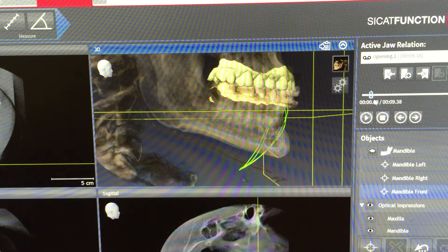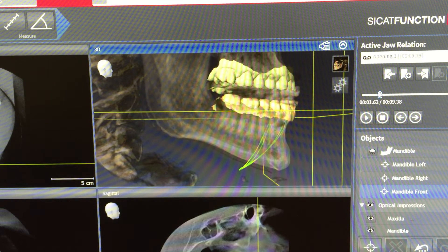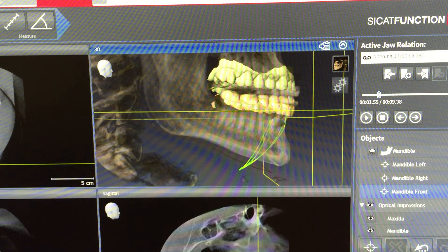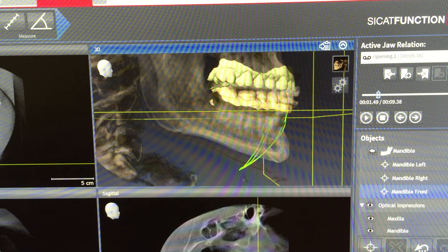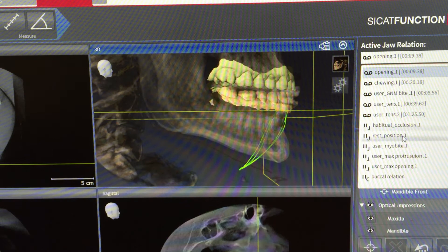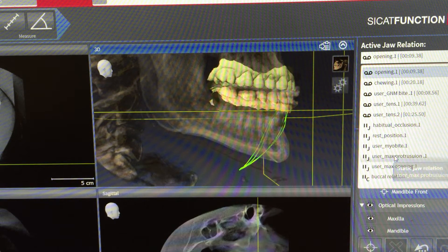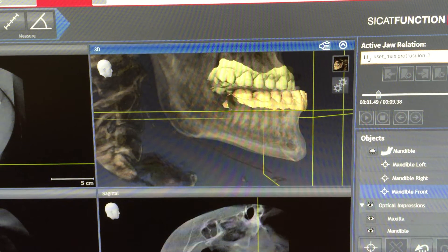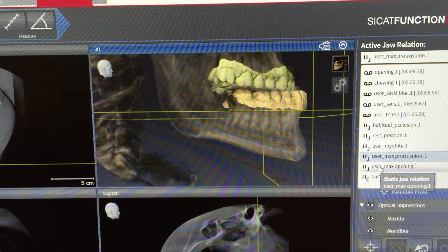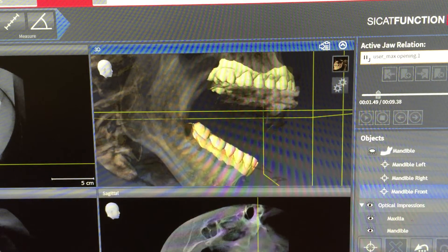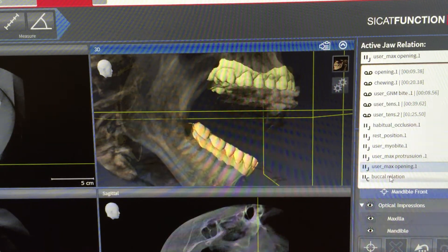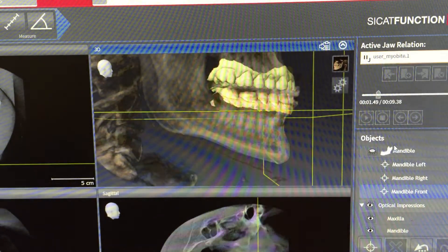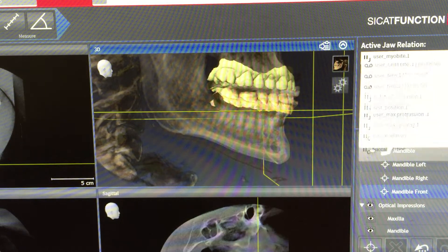I'm checking this arch form and I can see that this is the position before the condyle and everything compresses. I have records previously taken — when I captured my optimized bite position for the patient — including the different positions for maximum opening, maximum protrusion, and the position obtained with the bite.